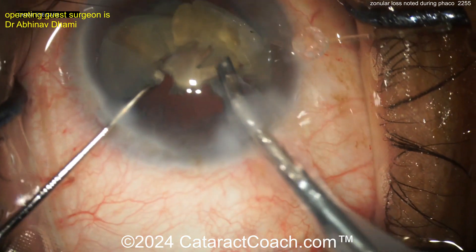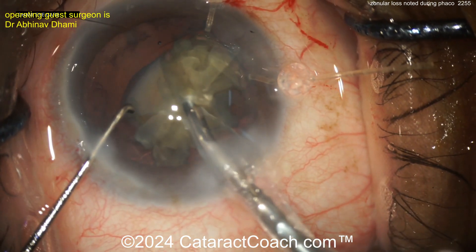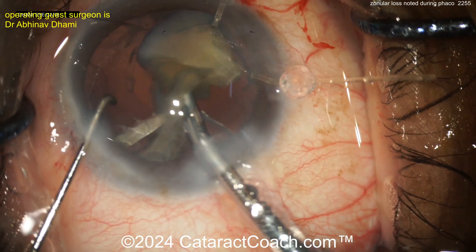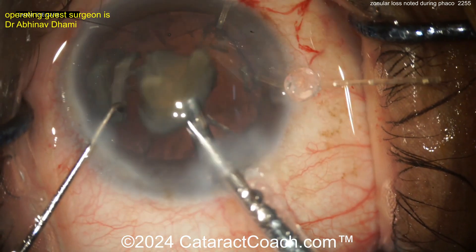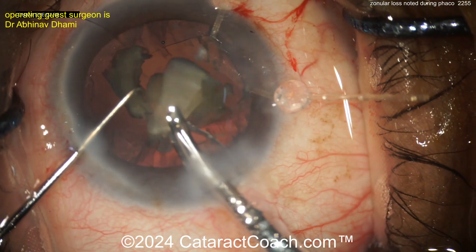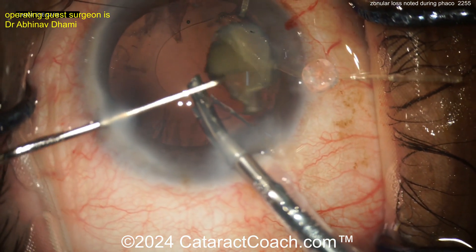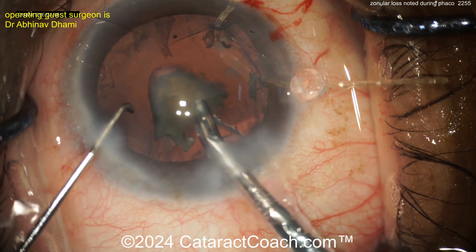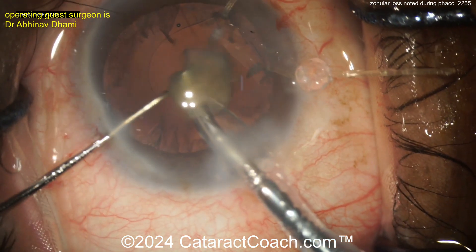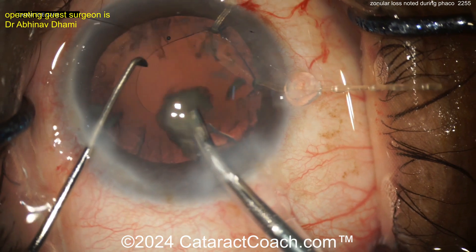The capsular bag is being held up pretty nicely — those two hooks are providing pretty good support. So perhaps this is a traumatic cataract and there's a focal area of zonular loss instead of just global zonular laxity. As these material pieces come out, it's very important to prevent the bag from coming up too, because the bag is extra loose. Keep the chopper in the safe position underneath those pieces with the smooth end of the chopper down. You may want to put more viscoelastic in the bag as a barrier so when you take these pieces out the bag doesn't come forwards. You may also want to adjust your fluidics for a little bit higher infusion pressure — that can help slow down your aspiration flow rate. That misty smoke you see is the FACO probe vibrating and aerosolizing the BSS on the surface of the eye.